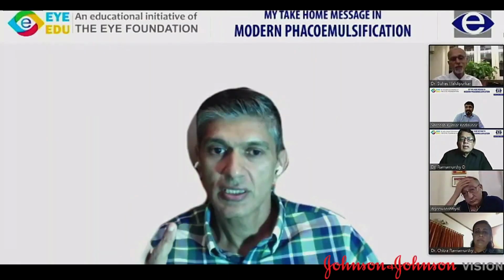Very often you may find a pterygium which is not giving you a lot of astigmatism. And anyway, that patient is good for a monofocal. He is not a premium IOL class. So I think this is a beautiful take, where most of the patients belong to this class. And for surgeons, this is a new way to go about. I'm sure most of them must be doing it, but at least I wasn't. But I think it's a new take and a good take. Well done.